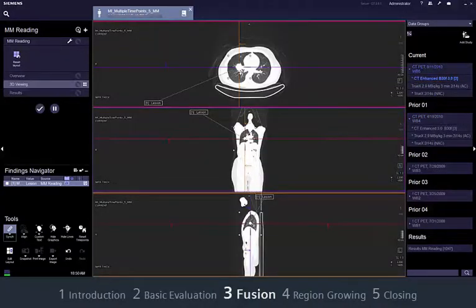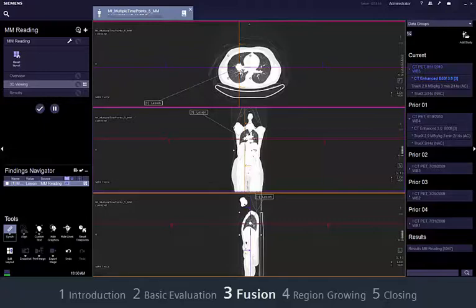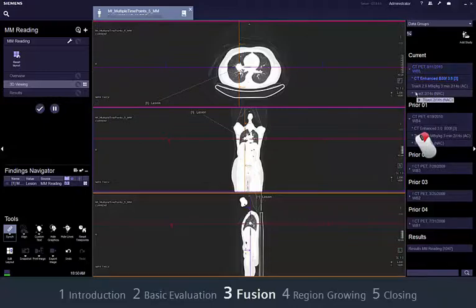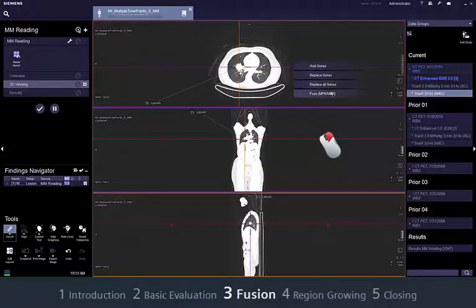Besides displaying different data sets side by side, you can also fuse images from different modalities, for example a CT data set with a PET data set. In this example, the image area already contains CT data. To fuse this data set with a corresponding PET study, go to the series navigator and select the series. Right-click and drag the series into the segment that already contains a series, then choose Fuse MPR/MPR from the context menu.